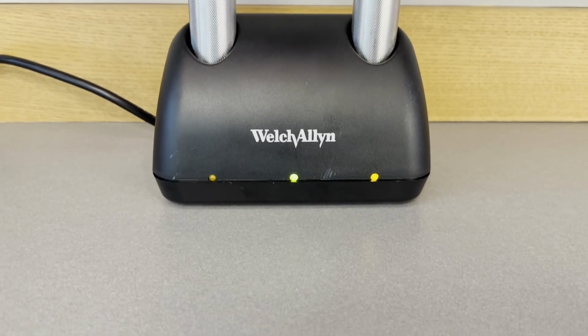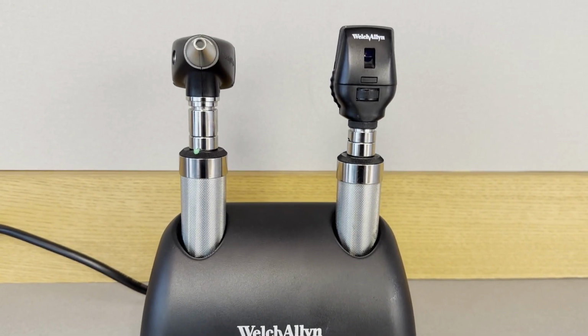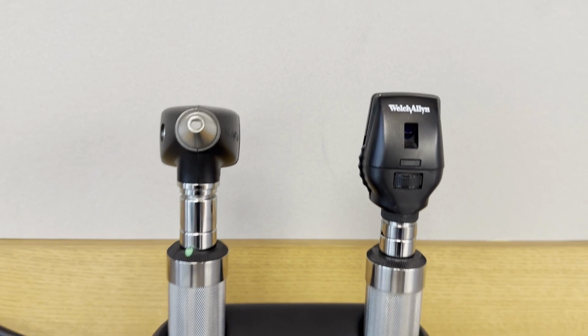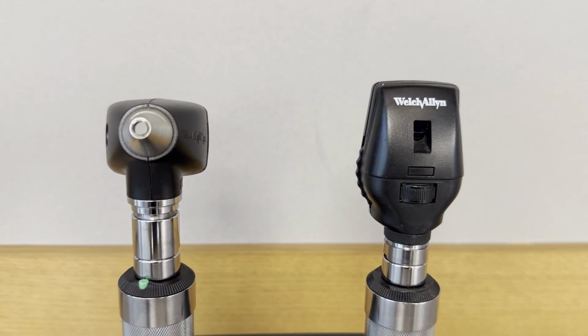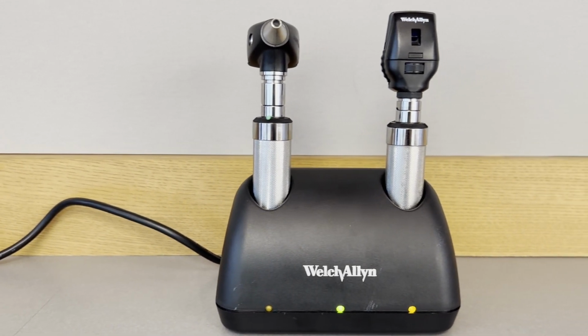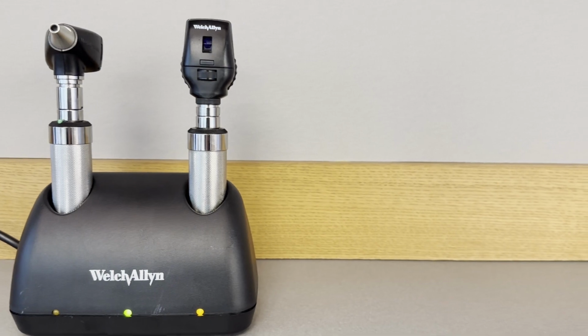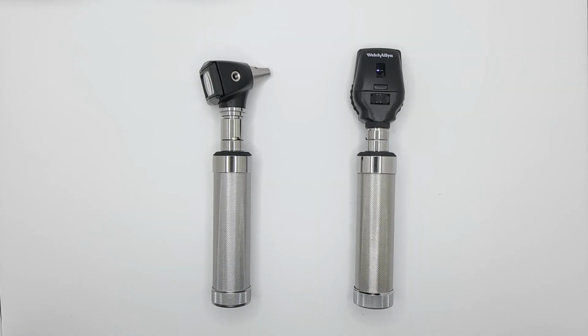In this video, we will first introduce the design and function of otoscopes and ophthalmoscopes. We will show how they are assembled and how they operate. Then, we will discuss two primary problems associated with otoscopes and ophthalmoscopes: a light that does not turn on, and an image that appears blurry to the user. Various possible solutions will be discussed for each problem.